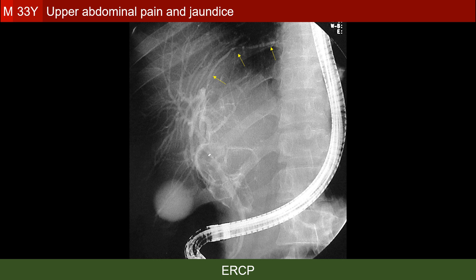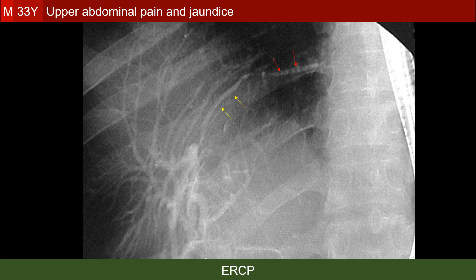The second important observation is the focal dilatation of one bile duct very close to the cyst, which contains also tiny filling defects. This is a magnified view showing the dilated duct in the vicinity of the cyst and the small filling defects within its lumen.